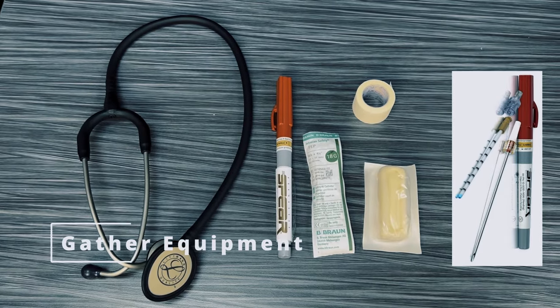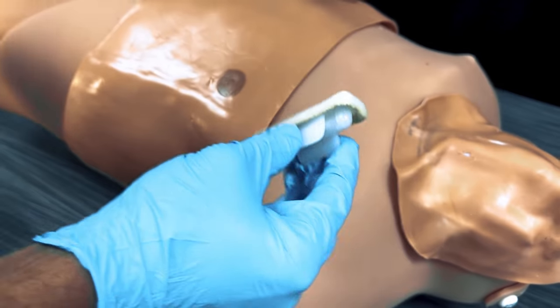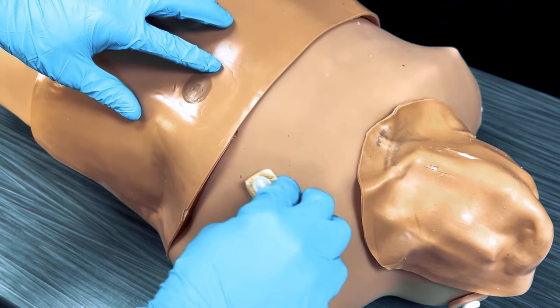Gather the necessary equipment including the spear needle with the included one-way valve, chlorhexidine wipes, and a stethoscope. To begin, cleanse the site with chlorhexidine.